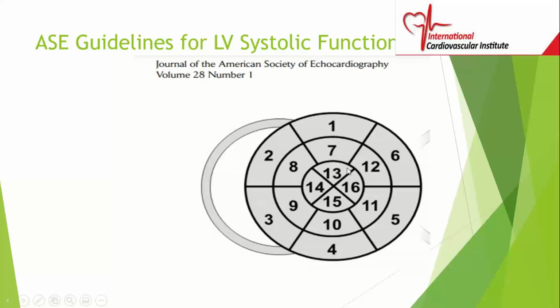The inner circle is the apical region of the heart. Then just outside of that is the mid segment at the level of the papillary muscles. And then this outer segment is what we call the base, which has the mitral valve in place.